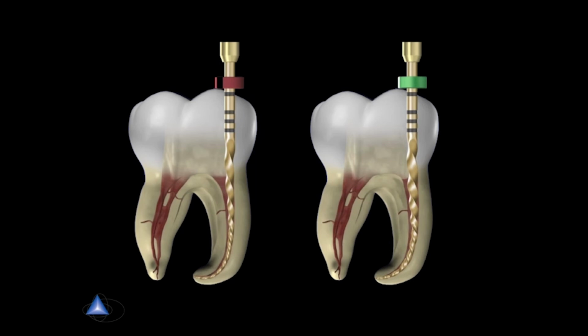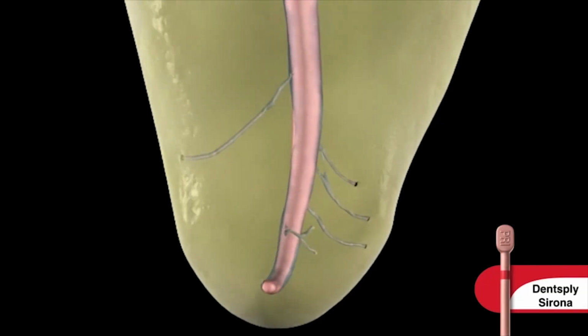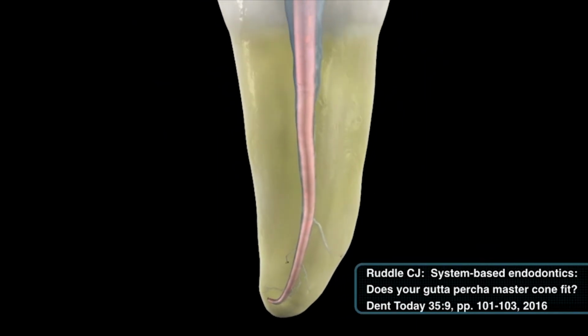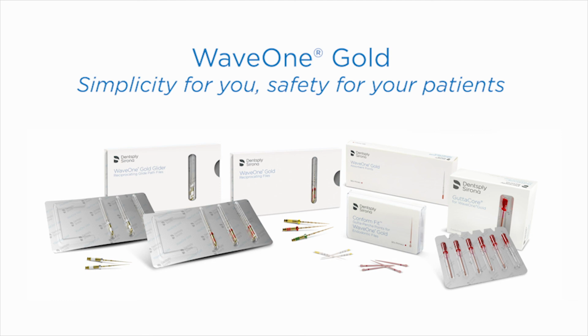Alternatively, you can gauge with a nickel titanium 3502, but remember, when we start to get up over size 30, even in the world of nickel titanium, the instruments become a little bit stiff. So in these instances, I would rather you gauge with a smooth, flexible, matching gutta percha cone from Dentsply Sirona. Those are the new cones I was speaking about that have superior sizing and formulation. Slide it in, and if it gets to length, then you can pretty much be certain that that's their terminal diameter. You would use this method and so forth to see if you want to go to the large or not in those instances where there is a big system with a big apical diameter.